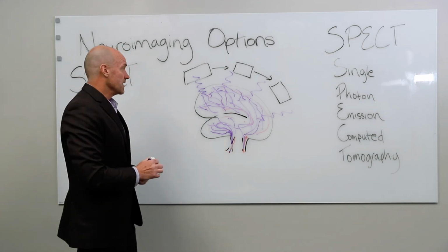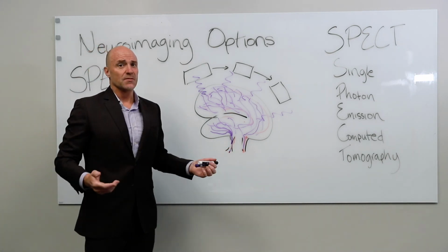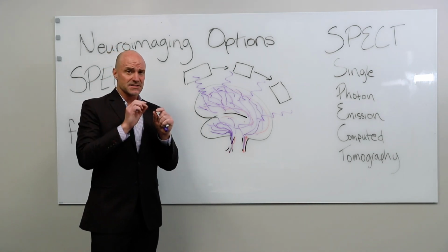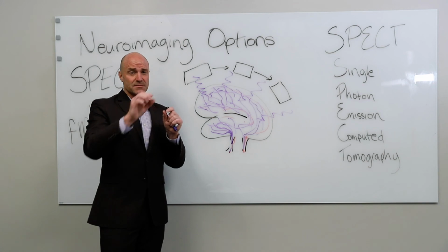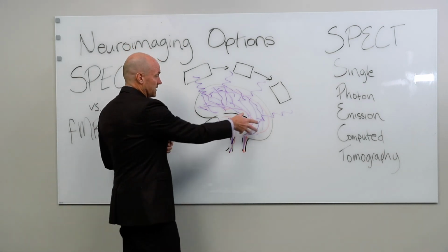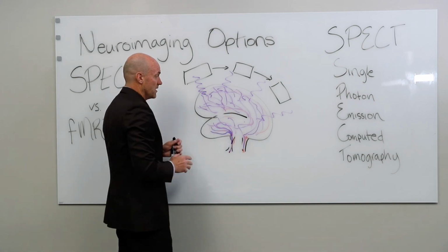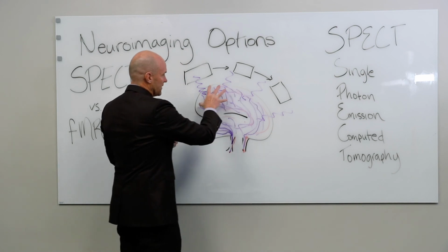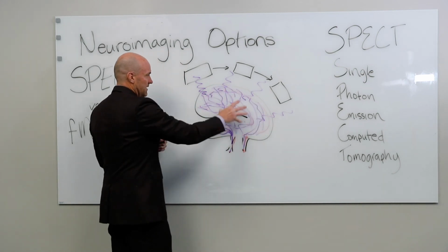Well, the thing is that where stuff was going on was everywhere, because any cognitive task, like I said, engages discrete regions, but those discrete regions are all over the brain. And so if you're only looking at these gross level blood flow measures, you're basically going to get big areas that are detected.